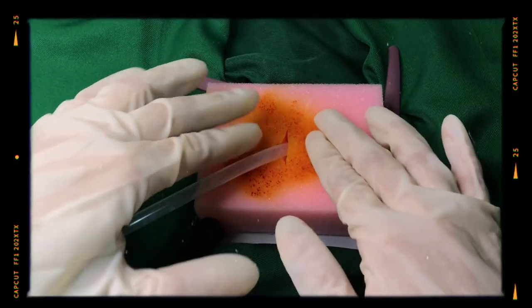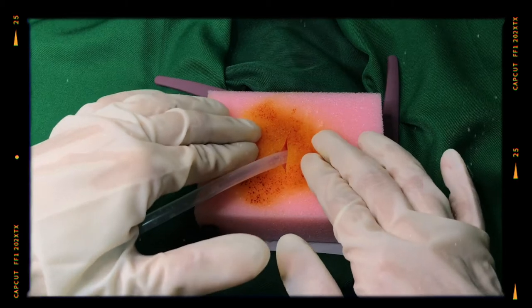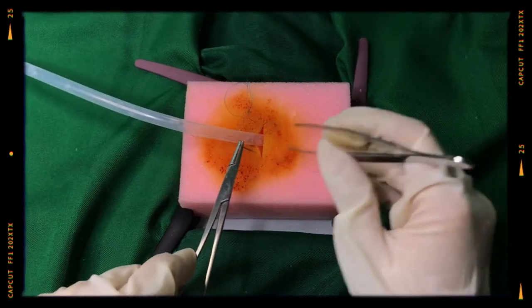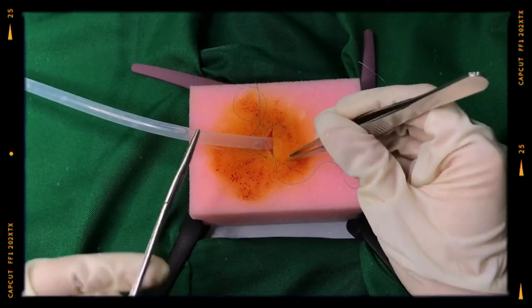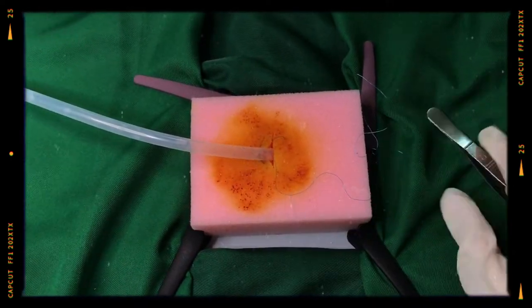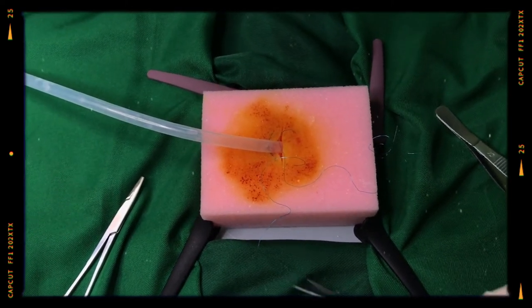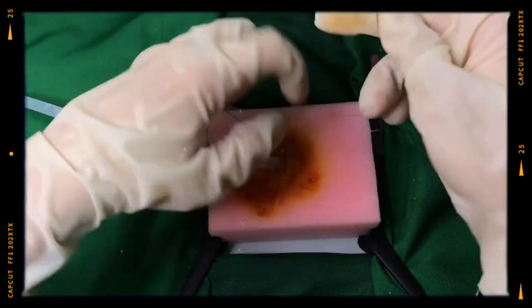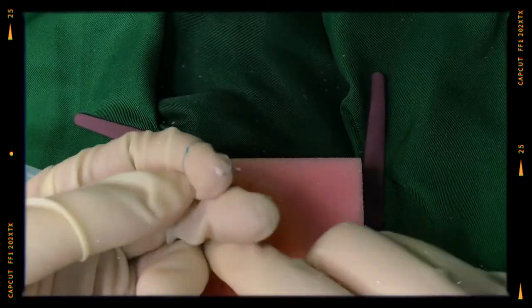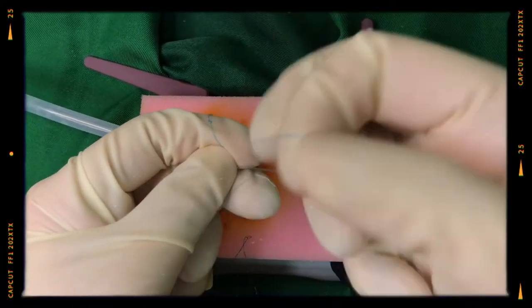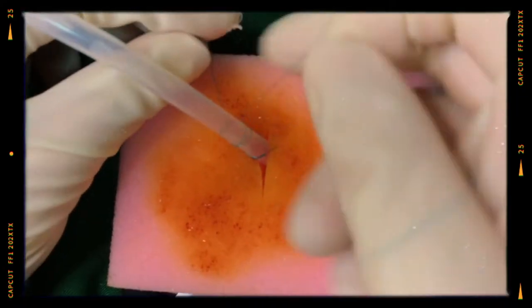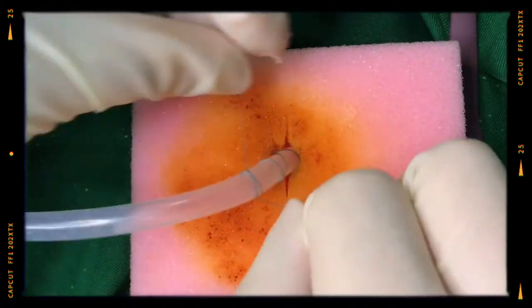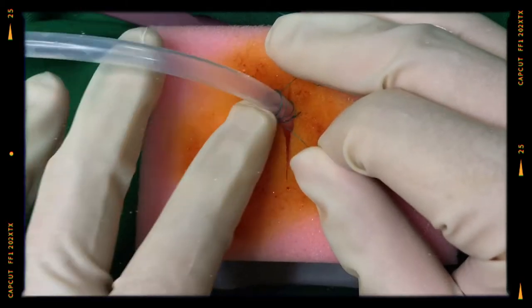Palpate superiorly and inferiorly to ensure that the tube has entered the chest. Suture the tube to the skin with a silk suture by placing a horizontal mattress. Cut the needle and put it away to avoid puncture wounds. Tie the suture in place tight to the skin. Wrap the ends in opposite directions around the tube to form a series of X's until to at least 4 loops around the tube. Push the suture down to the skin edge.